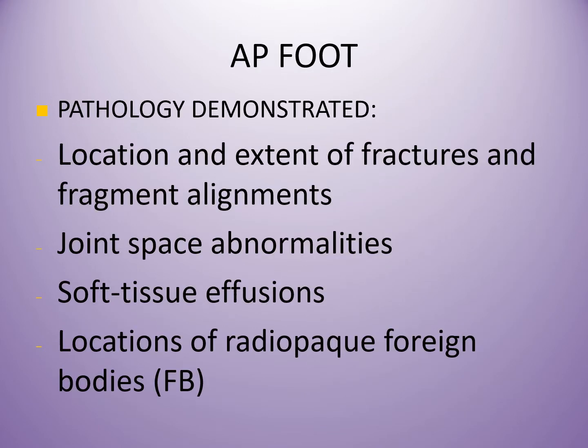Alright, go for the AP. Straight away for AP, anterior posterior of the foot. This is all the indication. Okay.